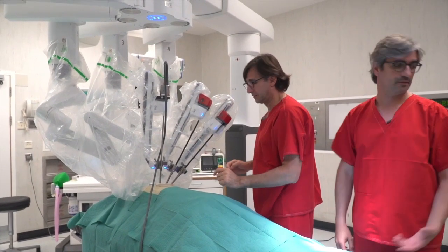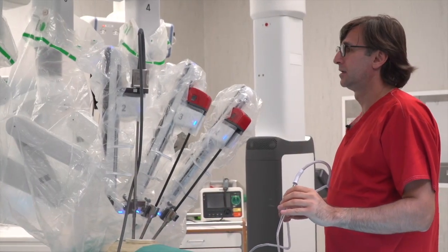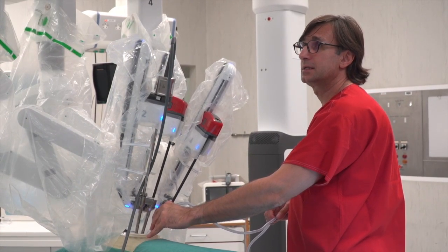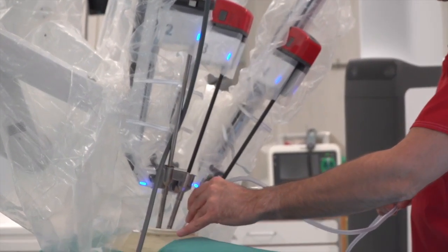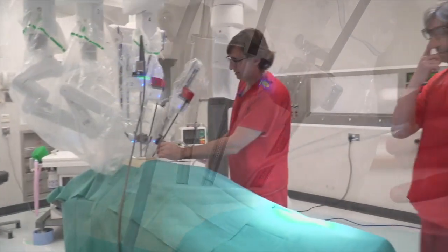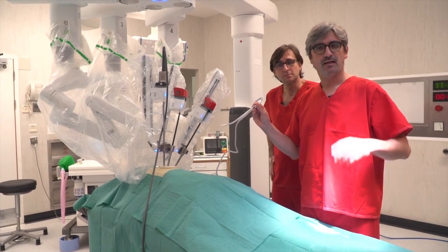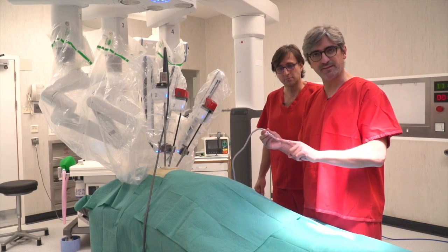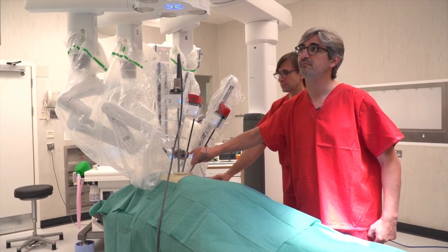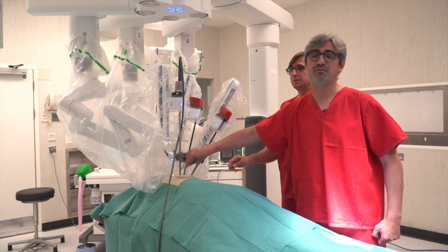Then you are ready to go for the console surgeon. The console is here. I will take the suction. So now I'm ready — you see, ready to go everywhere. The assistant with the suction will follow the surgeon. One important detail: the assistant must use the suction because the instruments used are only two or three. It should be a long curved metallic suction. He has to see the space to help — to expose, retract the lung, suction, remove the blood or liquid or whatever.